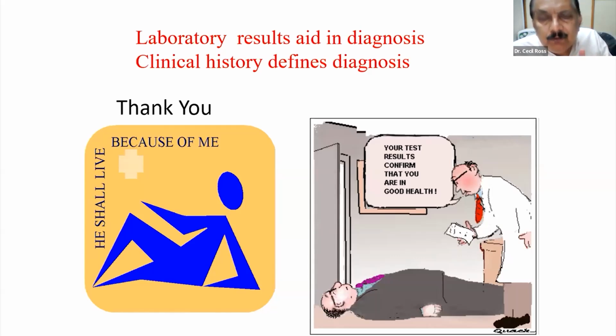Supposing you have a mild factor 13 deficiency, you actually have to do an assay, because if you diagnose mild factor 13 deficiency, you can give prophylaxis so that he won't develop an ICH. So it is important to do the factor 13. Otherwise, if he has a spontaneous IC bleed and the PT is prolonged, repeat the PT and PTT. But if the PT is normal, in the elderly fellow with normal coagulation assay, I would like to do factor 13.